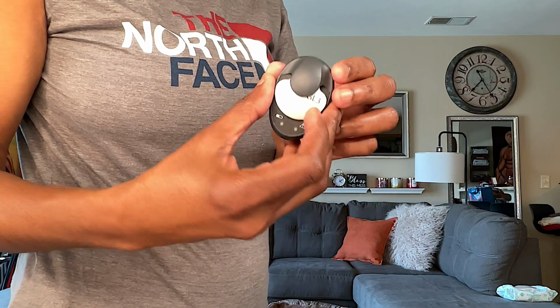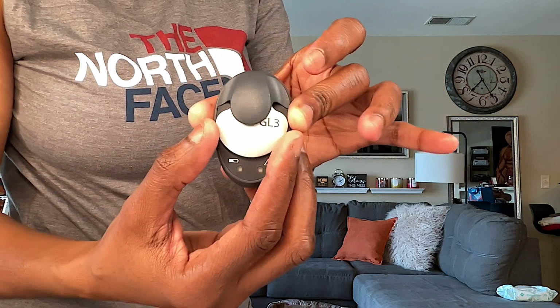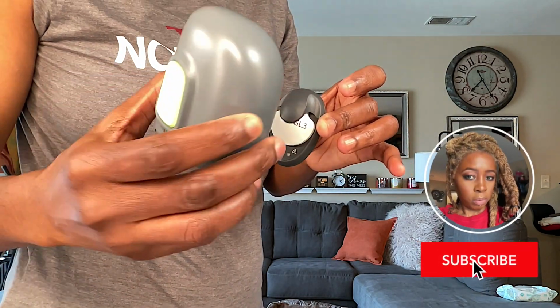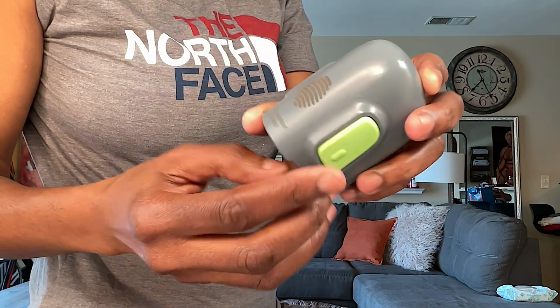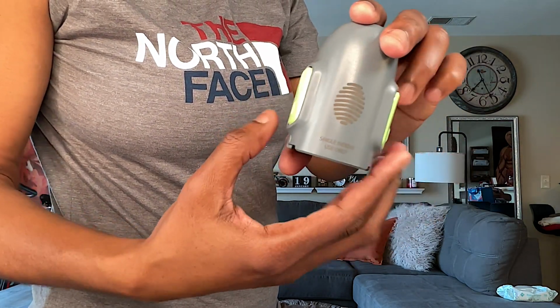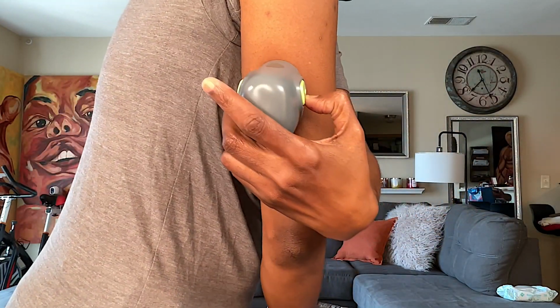So now it's time to remove this quickly after I secure the sensor. Once I secure the sensor, which is inside of this, that's a sensor with a needle. This green color here indicates where I would press in order to get the sensor attached to my arm. So here we go.